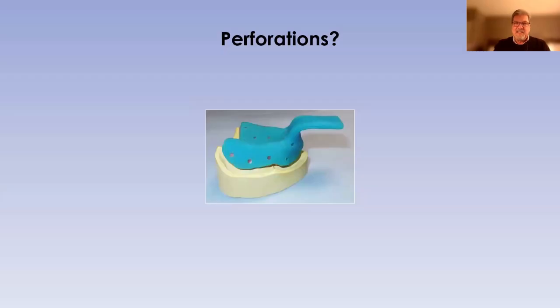Perforations, the same thing. A lot of times we get asked for perforations on the tray. You don't really need it now with the adhesive, especially with polyvinyl impressions. With perforation, sometimes a lot of the material runs out of those holes in the tray and you're losing material. So it's up to you, but I'd rather have a solid tray.